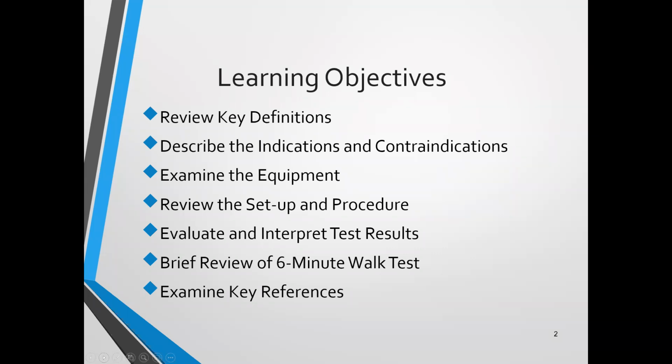So that's really the next bullet point, evaluating and interpreting the test results. We'll take some classic examples and talk about those. But I also included a few slides on the 6-minute walk test. The 6-minute walk test has not replaced cardiopulmonary exercise stress testing altogether by any stretch of the imagination.